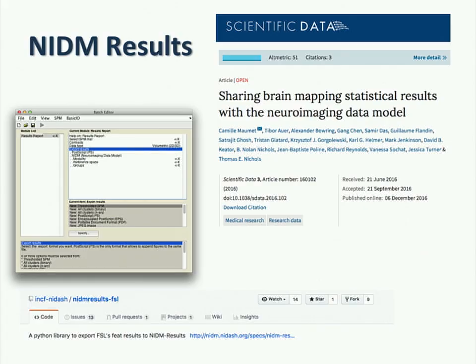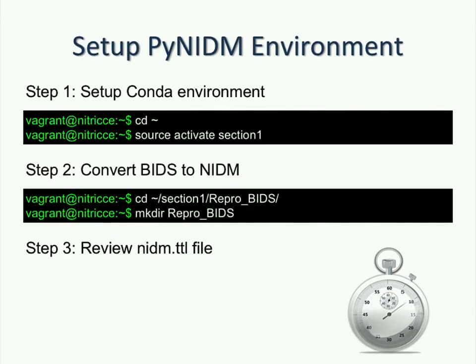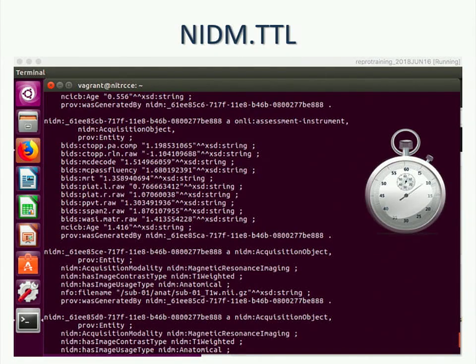Again, these standardized structures for data allow this type of movement between systems. Then there was another exercise that I'll point you to that uses Conda to run some of the experiments, and what this generates at the end is what's called a turtle file, a .ttl file.